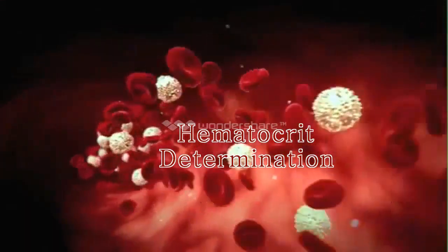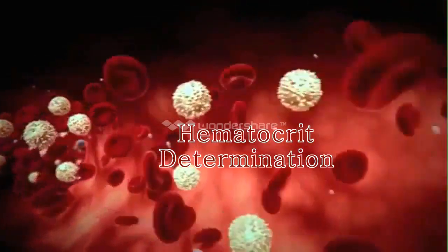Hematocrit determination. Our objectives for this experiment are to demonstrate the proper hematocrit procedure and to know the importance of the test.